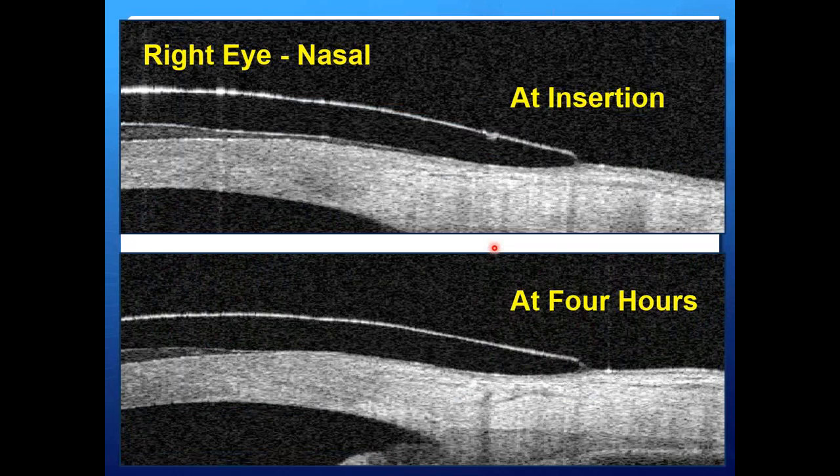Now, when we allow for the settling, what we want to see is, do we have vault through the peripheral cornea and limbus prior to settling, and then very importantly after the settling, do we see if that lens has settled into touch? If your scleral lenses land on cornea, then it's often possible that they'll get some staining. So it's really good if we can see after settling we have no peripheral corneal or limbal bearing.